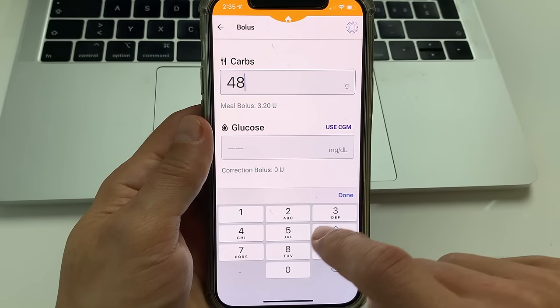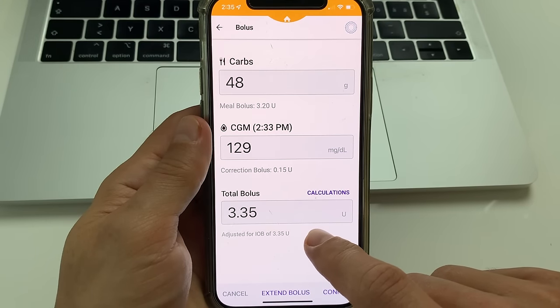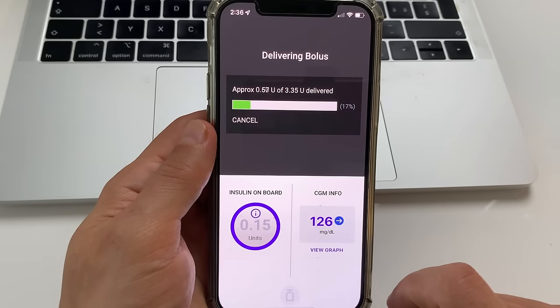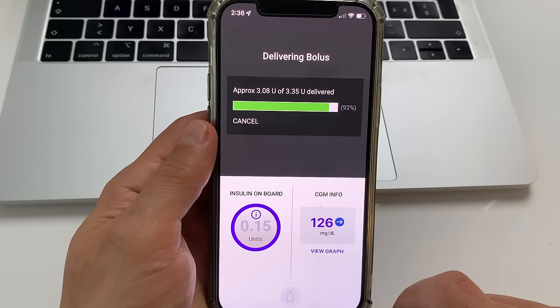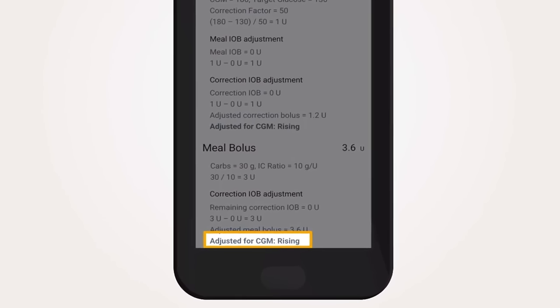Another unique feature of Omnipod 5 is the smart bolus calculator. When you take your insulin shot with your meal, the smart bolus calculator takes into account not only the amount of carbs you eat and the current glucose level, but also the trend of your glucose. Each bolus is automatically adjusted depending on whether your glucose is trending upwards or downwards. One thing to keep in mind is that Omnipod 5 can only be connected to one controller or one phone. Anytime you switch from one controller to another, the algorithm will lose everything it has learned, so always be careful before making these changes.